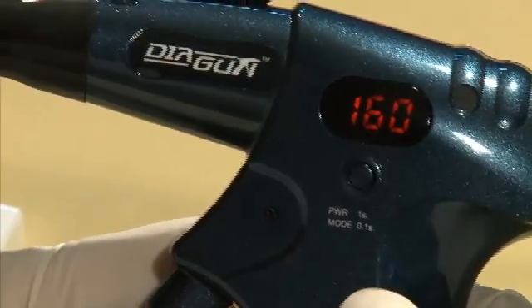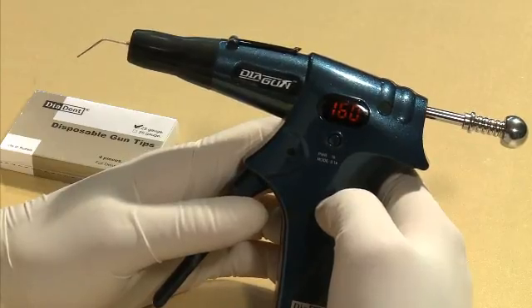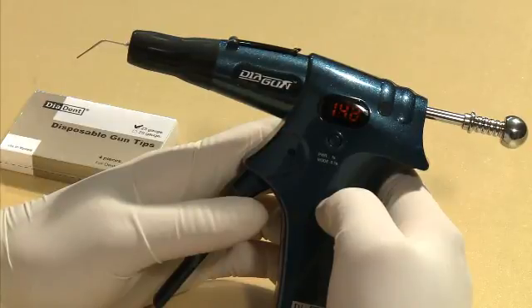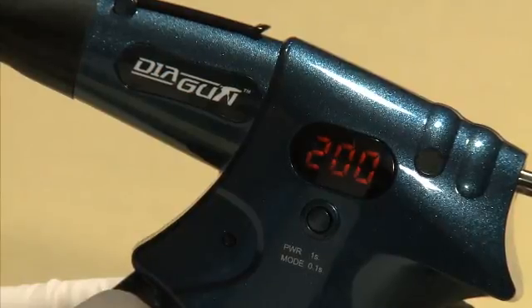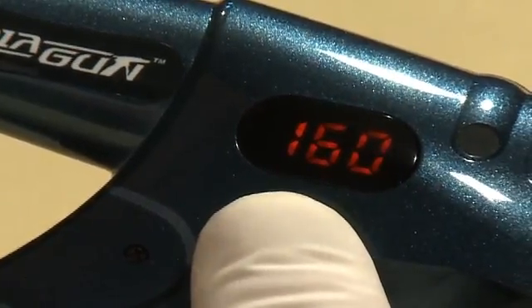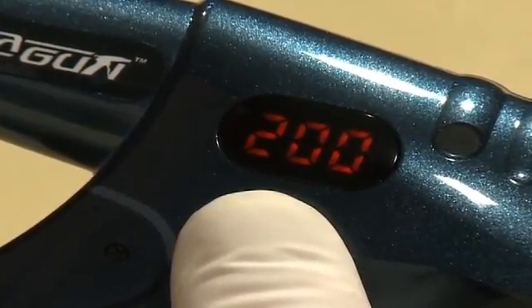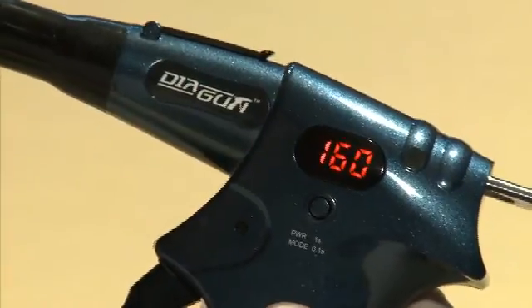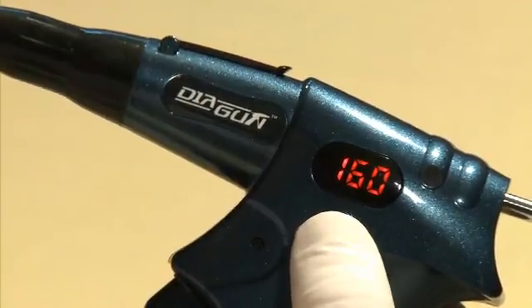Press and hold the power button for one second to turn on the device. The temperature will automatically default to the previous set temperature — 160 degrees Celsius. The display shows the current heating temperature as it heats up; it takes approximately 25 seconds to reach the highest temperature setting of 200 degrees Celsius. Press the power button again to select a preset temperature of 160, 180, or 200 degrees Celsius. Once the temperature begins increasing to the selected temperature, it is not possible to adjust it anymore.